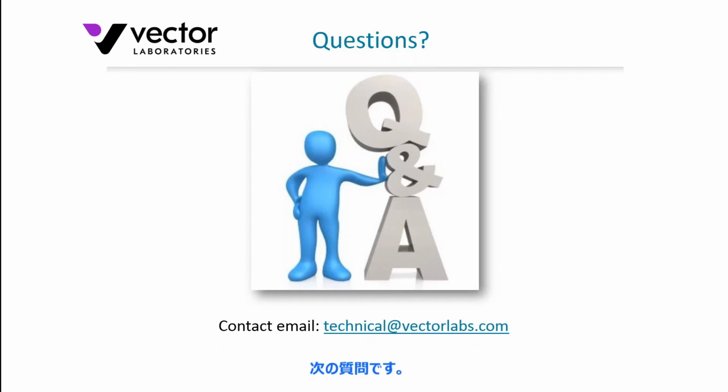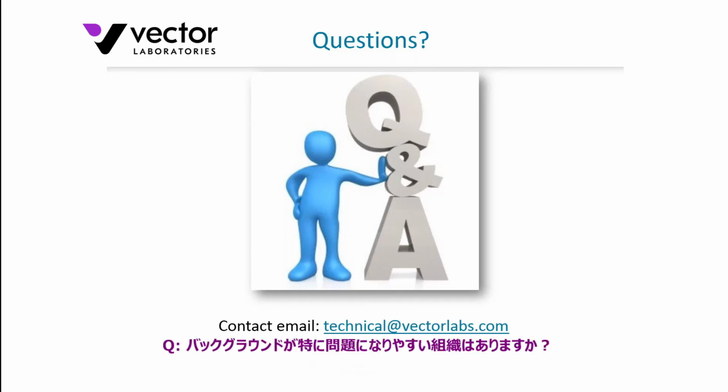Okay, great. The next question: are some tissues more problematic than others for background problems? Yes, they are, and that may depend a little bit on the application you're working with. Certainly mammalian tissues such as kidney and liver do tend to sequester detectable levels of biotin in large amounts. So if you are working with an avidin-biotin-based detection methodology, they are particularly problematic. You could certainly avoid those by using a polymer-based system.